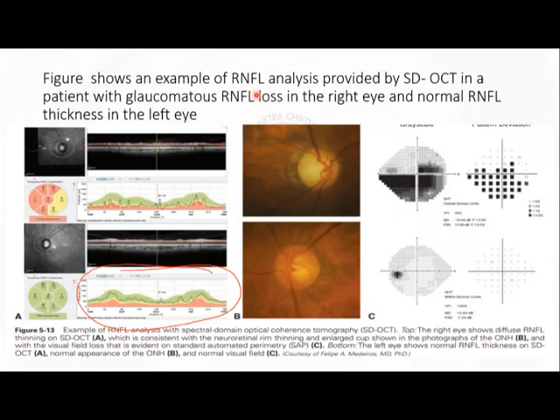The green, yellow, and red is the normal age-related graph. The dark line is our patient's graph. So that dark line should follow that double hump pattern if it is normal. If it is beyond the green line and fluctuating like here, like an ECG, then most probably it is not a good quality OCT.